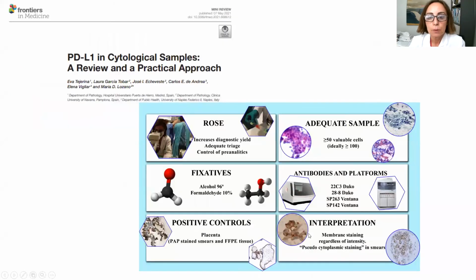This is a paper we published very recently, of course, because we published it. I recommend you read it and let me know if you like it. In this paper, regarding PD-L1 in cytological samples, we talk about the procedure, the roles, the adequacy of the samples, fixatives, antibodies and controls, and interpretation.